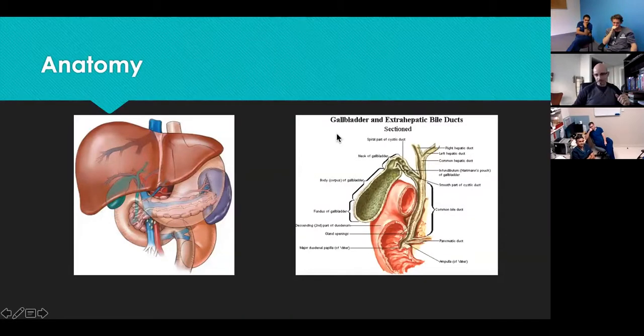If you remember, when we are looking at the AP, we have our stomach with the duodenum and the liver, the hepatic veins. What is important for us for the hepatobiliary scan is we have a quick look at the liver, the left lobe, the right lobe, both in two planes, sagittal and transverse.